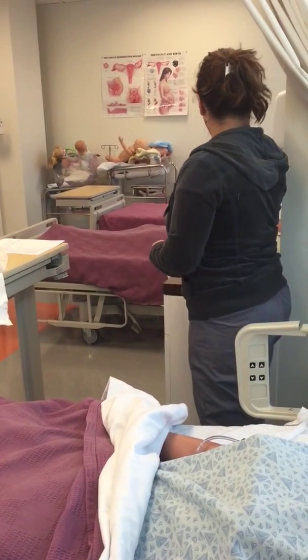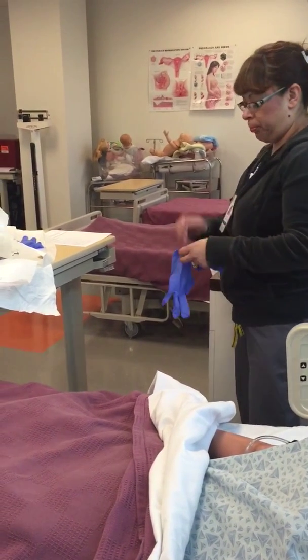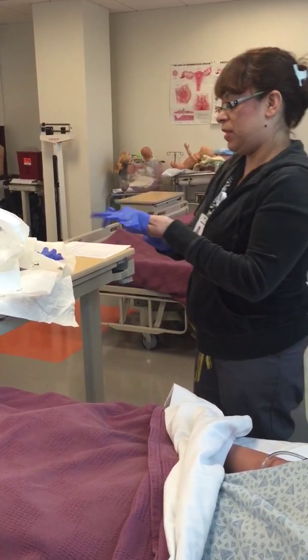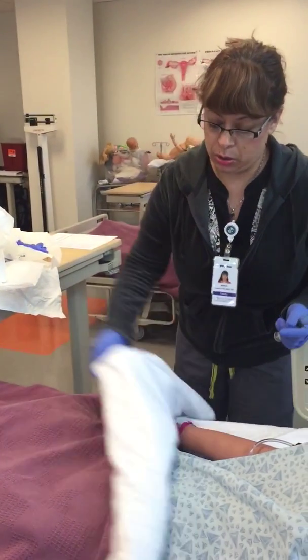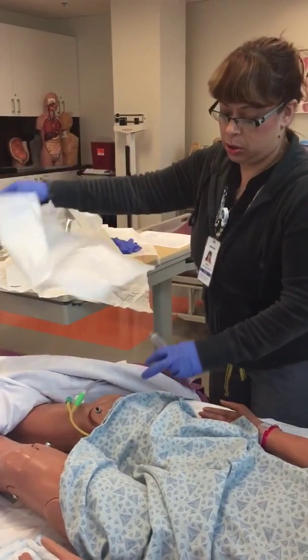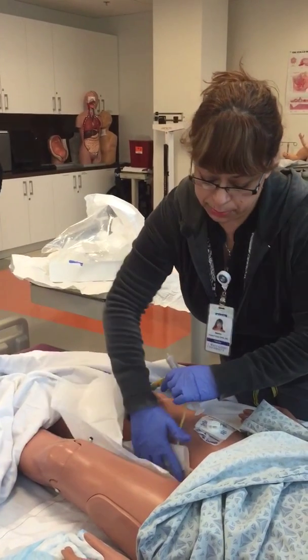Alright, so I'm going to go ahead and wash hands again, put a pair of gloves on. And I need a syringe with me. I need a 10 cc syringe because I need to remove this catheter. You want to bring a towel with you when you do this. Let's see, this is my towel. Let her know that I'm going to expose her. Put the towel here.